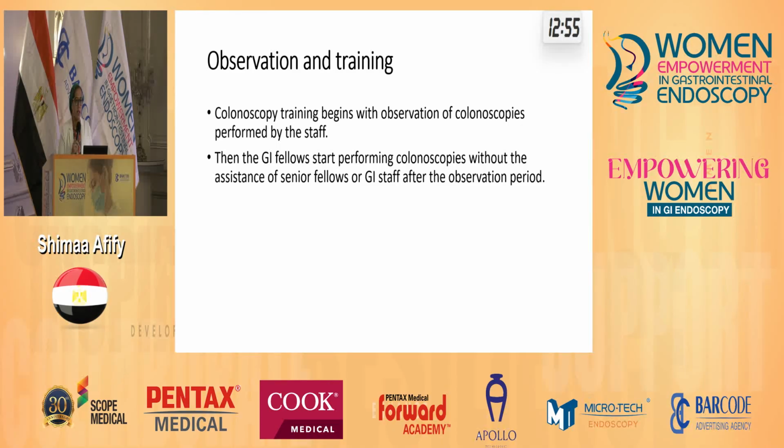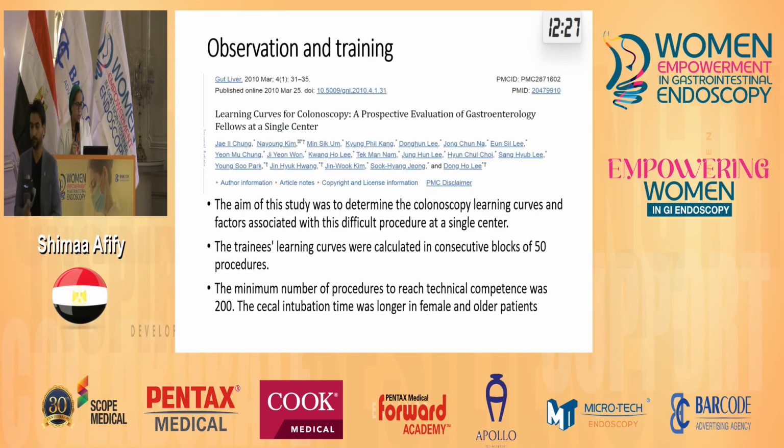As much as I observe our seniors in the endoscopy unit, this is how much I can learn about the imaging, about the disease, about how to diagnose a lesion and how to perform. Learning by watching is a very important step in learning colonoscopy. And then you start performing colonoscopy without assistance of the senior after some period of observation.